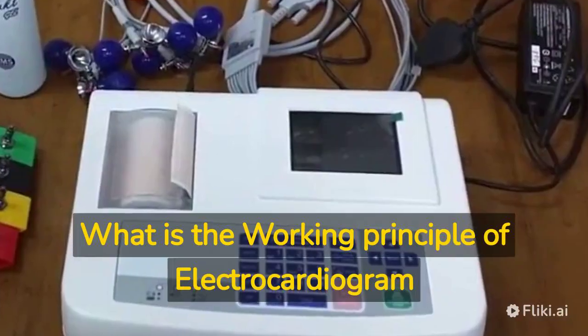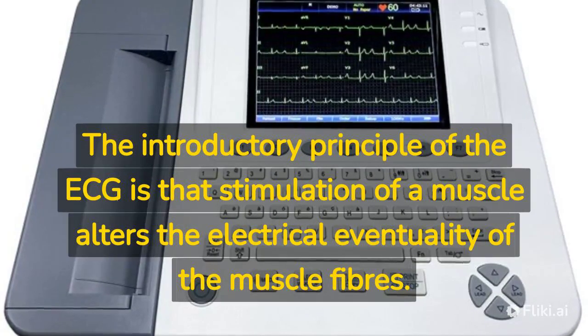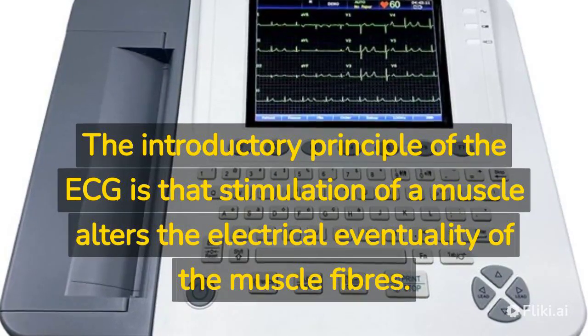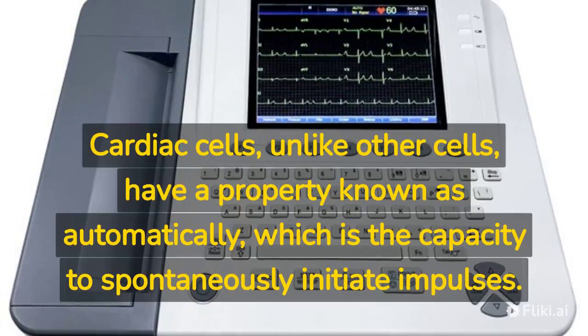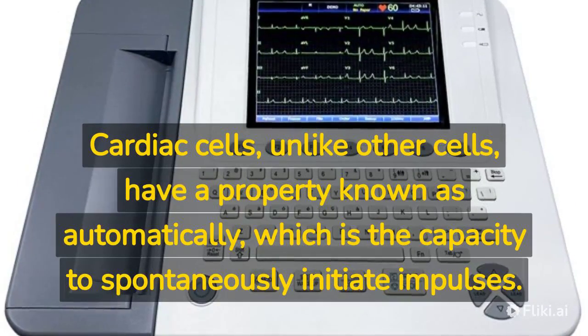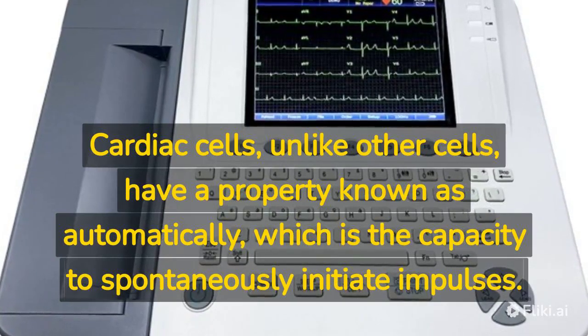What is the working principle of an electrocardiogram? The basic principle of the ECG is that stimulation of a muscle alters the electrical potential of the muscle fibers. Cardiac cells, unlike other cells, have a property known as automaticity, which is the capacity to spontaneously initiate impulses.